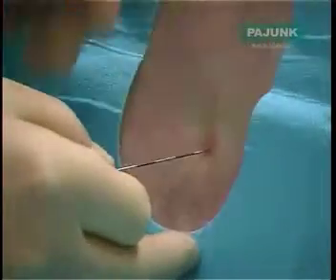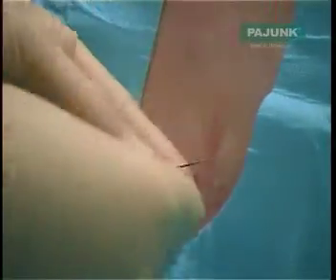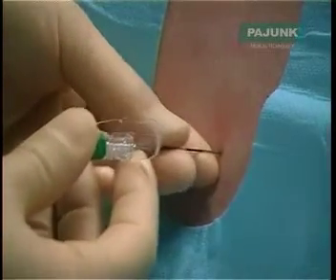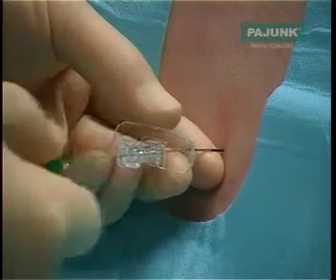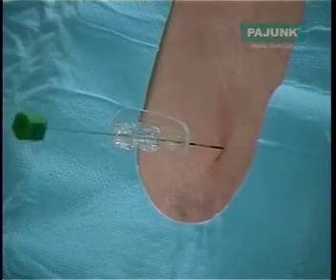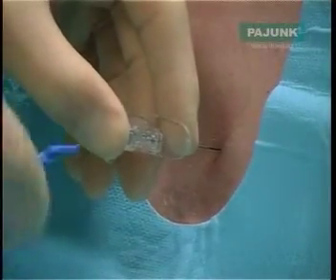The special sprot needle is then inserted in the usual way, and we just check for CSF as we go. The CSF comes back quite briskly, and it is important to replace the stilette while you get ready for the next part of the procedure. I usually put my thumb over the end just to stop any CSF leaking out while I attach the catheter.